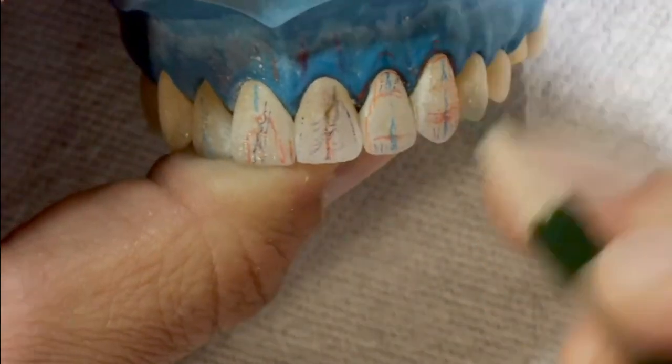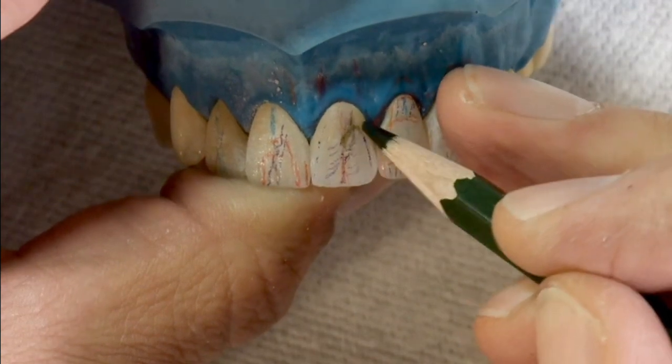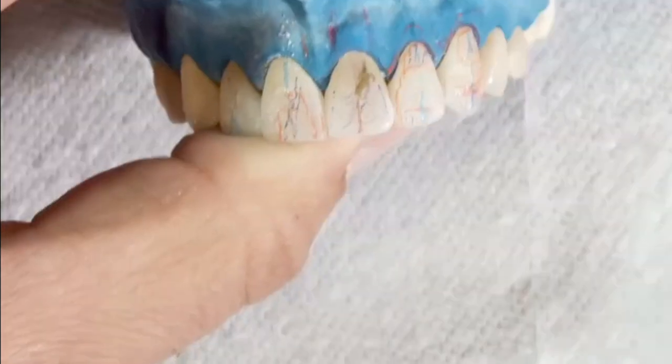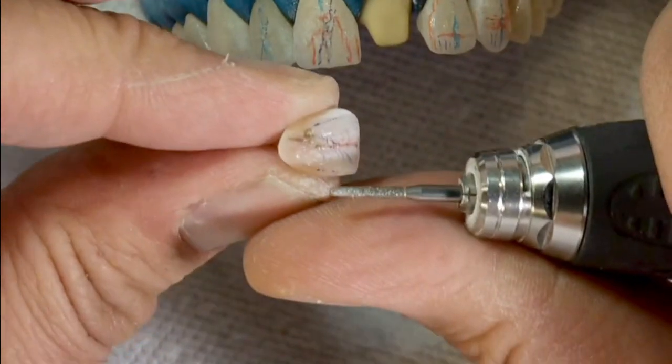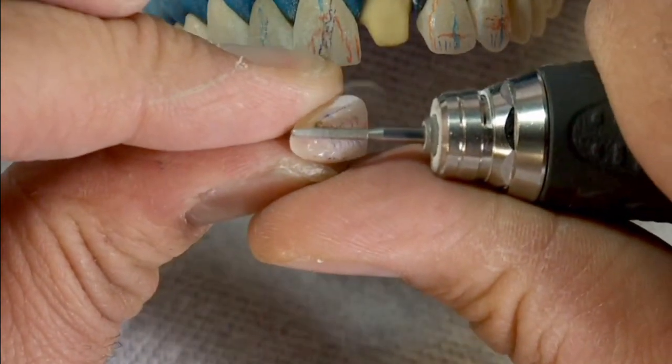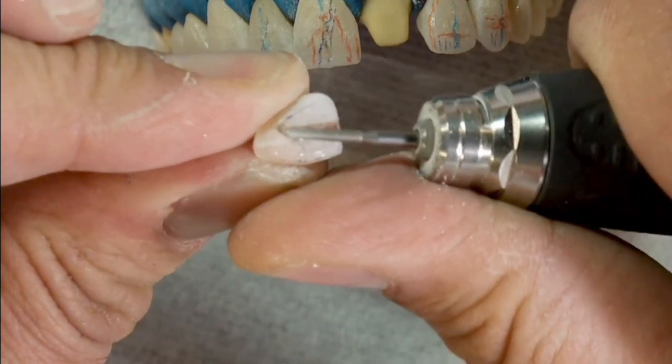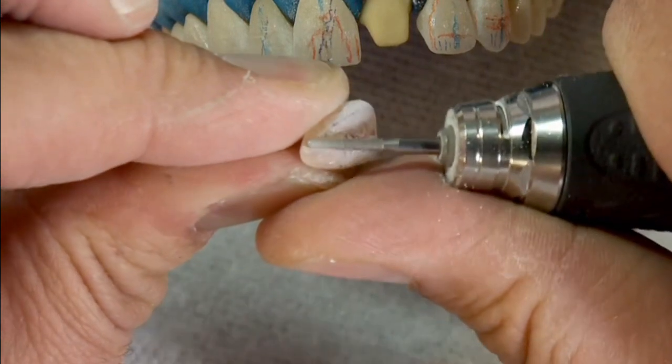The S-curve is a curving depression of the labial surface of an incisor in the shape of an elongated S. The curve starts in the disto-gingival area and blends into the central lobe, causing a pleasing visual blending of the tooth into the tissue. The S-curve tends to emphasize the length and fullness of the mesial lobe and shorten the distal lobe, reinforcing the long axis of the tooth.